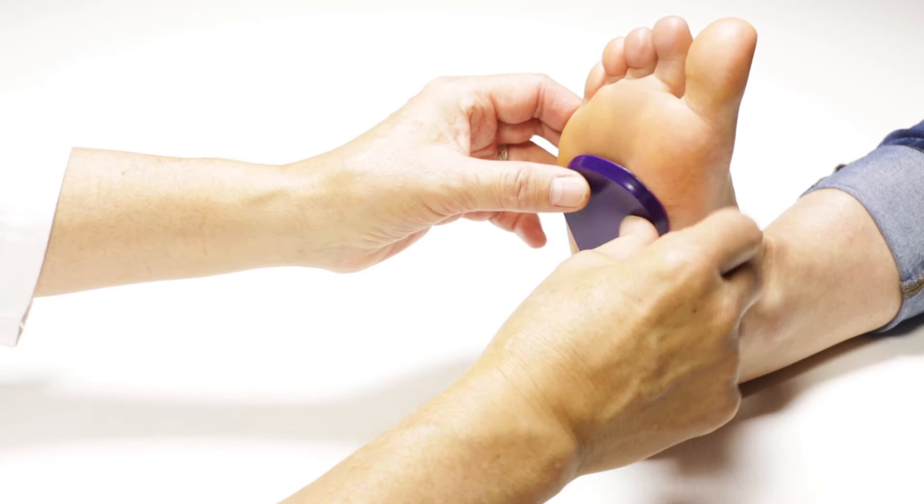Reusable Gel Metatarsal Pads are applied directly to the skin. The best thing about these pads is wash them with a little soap and water and they're sticky again. That's the secret to what makes them reusable.